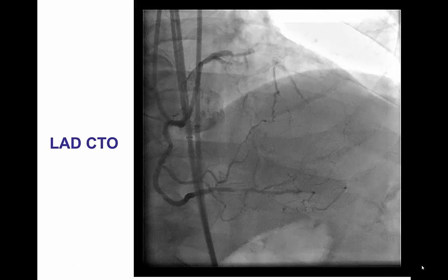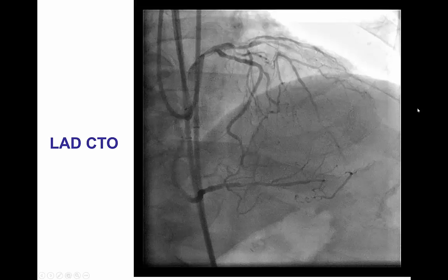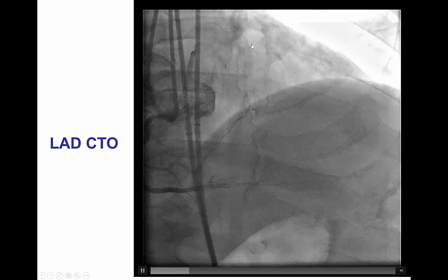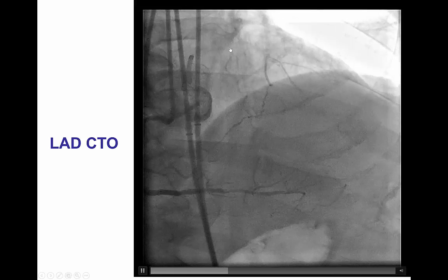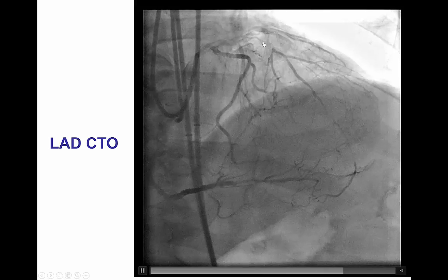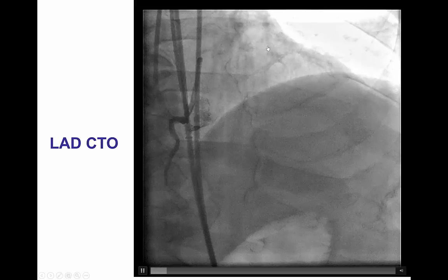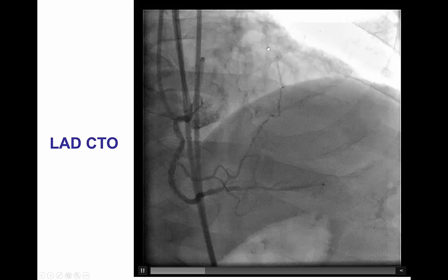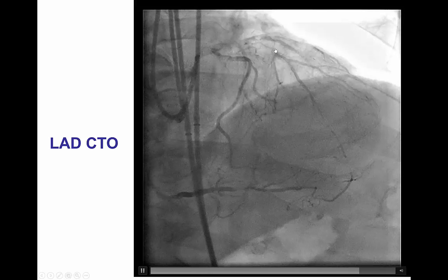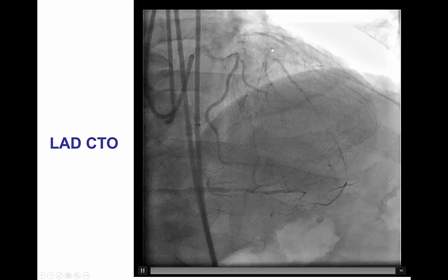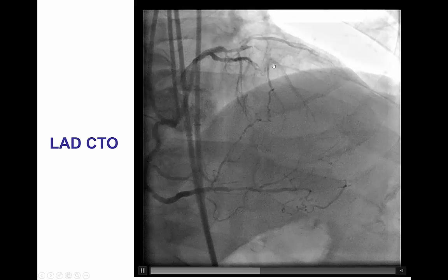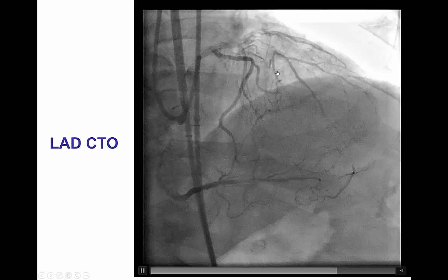This is the dual injection demonstrating a mid-LAD CTO. There is diffuse disease and calcification in the proximal vessel, with a tapered proximal cap. The lesion is short — the occlusion is less than 20 mm but heavily calcified. The distal vessel is of good quality.